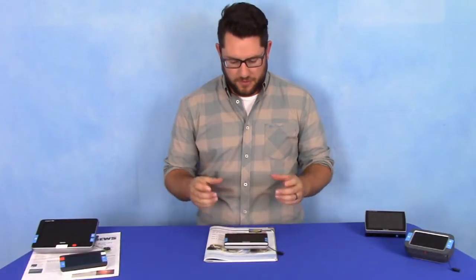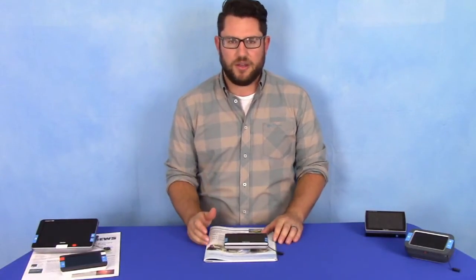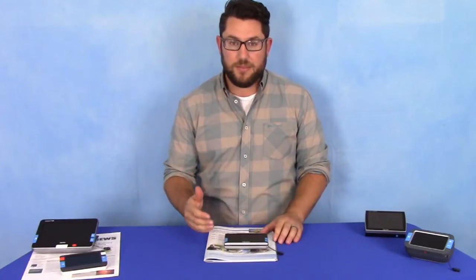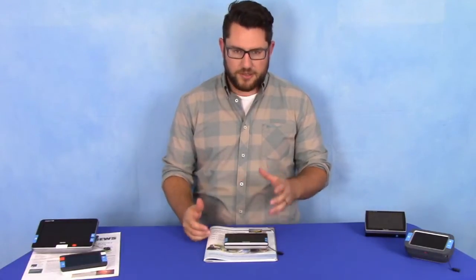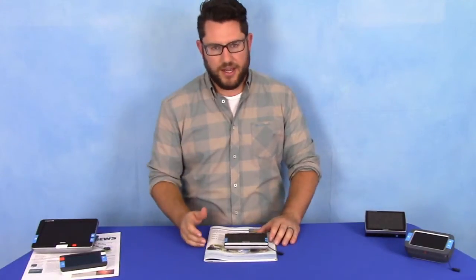It does have an HD camera, a full resolution screen, so this is a true HD product. Very high quality image, very crisp and clear, high contrast, black blacks, white whites — very easy to read, easy on the eyes.